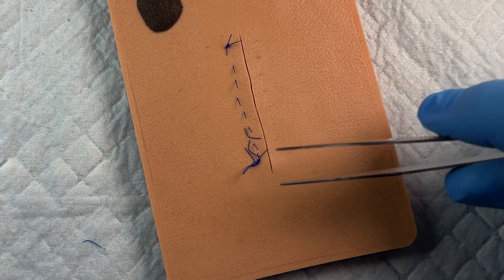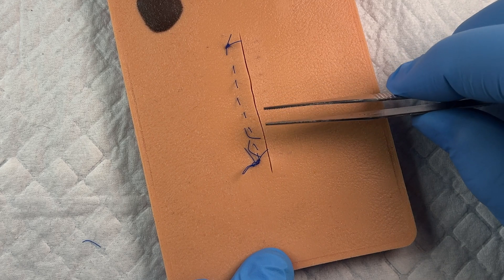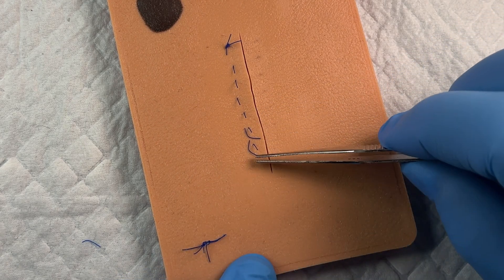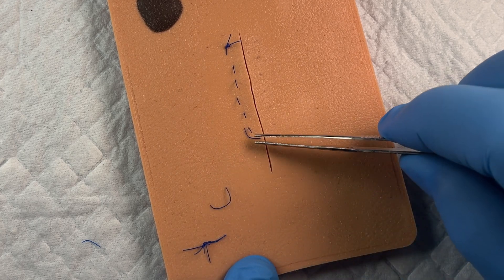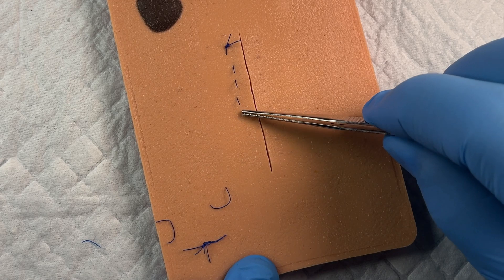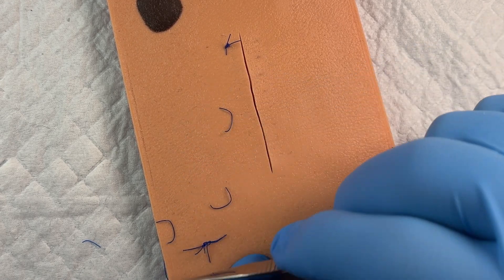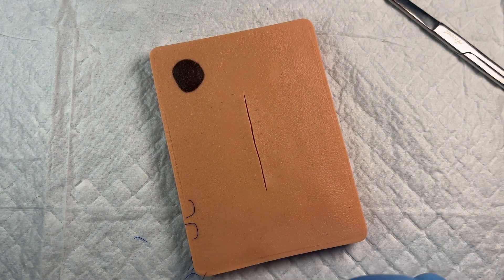And now it's just as simple as using your forceps and usually your suture removal kits are going to come with forceps that don't have teeth like this one. And you're just going to grab and pull. And notice what I'm doing as I do this, I'm not pulling any suture that was outside of the skin down through the tissue, thereby not dragging bacteria through the tissue as well. And so notice that it all should be easily removed just like that.